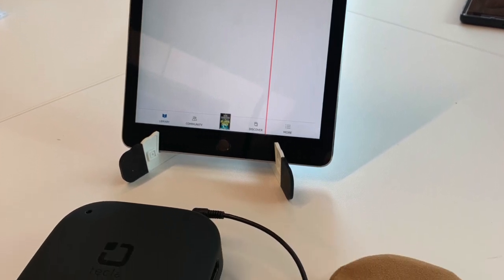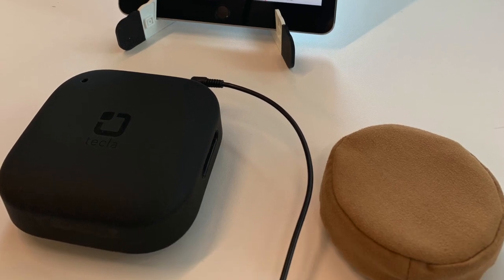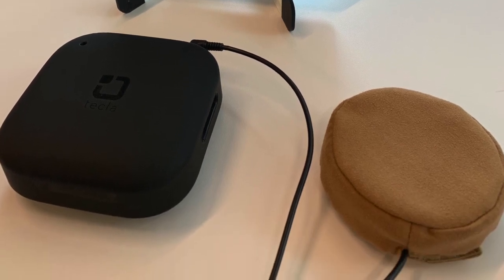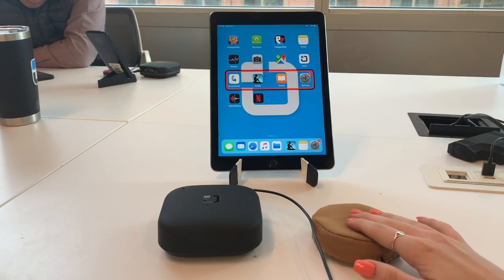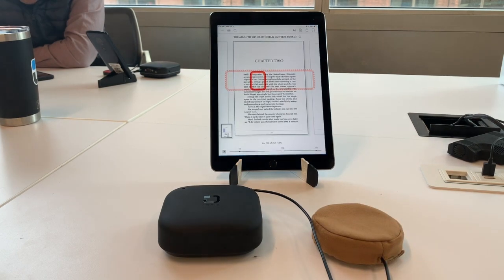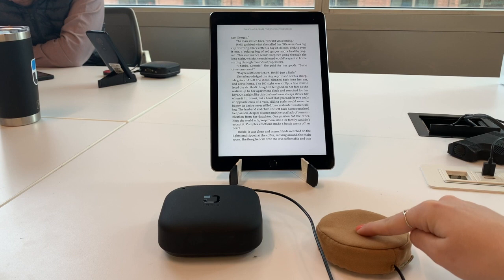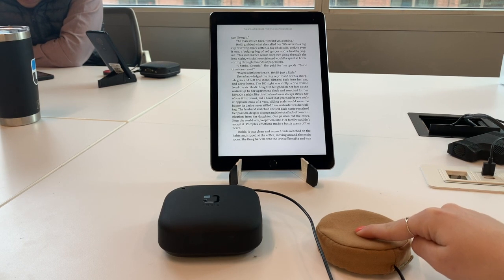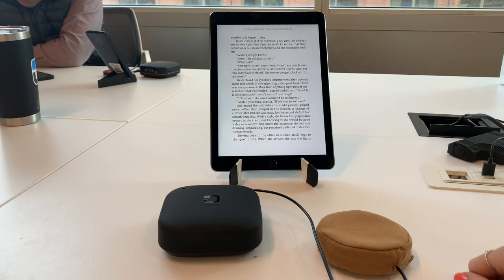and a pillow switch. These instructions work for any iOS device and can be used to read for leisure. To begin, select the Kindle app. As you can see, the user can flip to the next page by pressing their switch anywhere on the screen. To learn how to flip pages on point scanning mode, please continue watching.